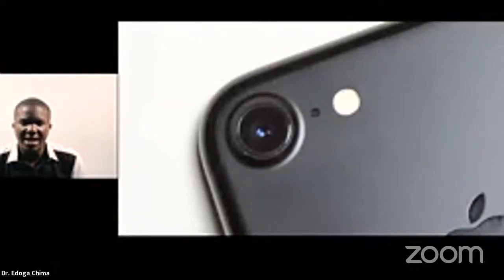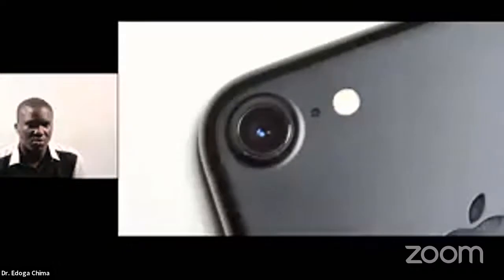The camera flash. In this image, sorry, I may not be able to do annotation, but you can see the camera, and you can see the flash by the side.